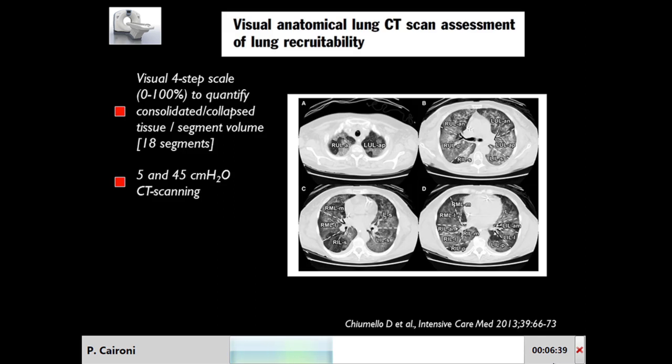This was, I think, a nice attempt to compare a visual assessment of lung recruitment with lung recruitment according to the quantitative analysis of CT scanning.